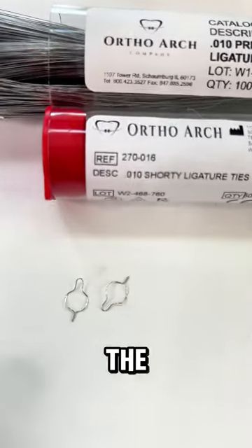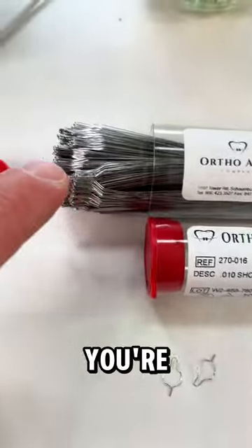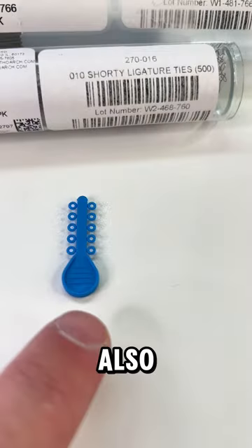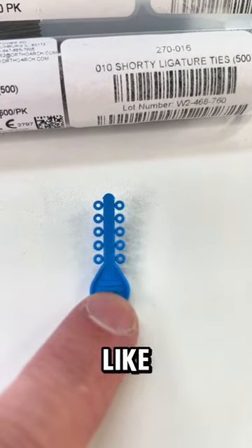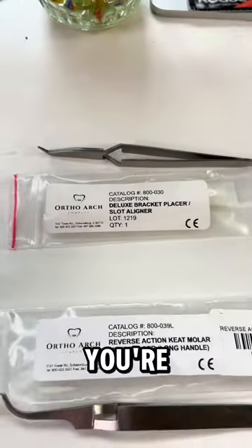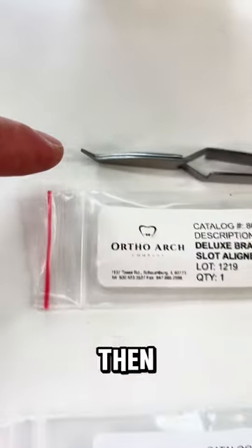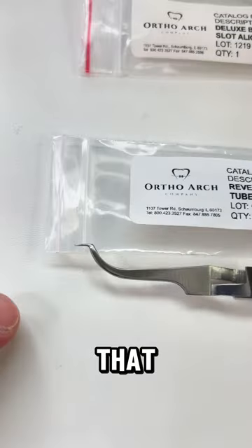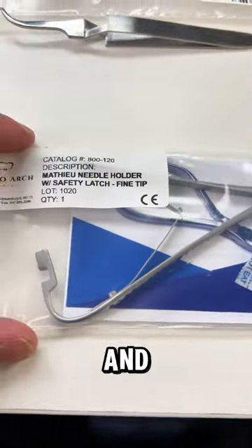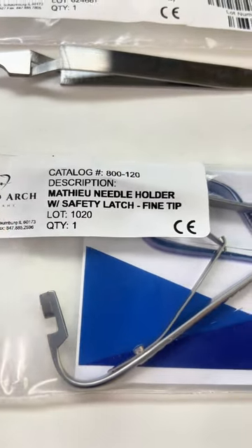You're going to need some ligature ties: short ligature ties, long ligature ties for lacing, and elastic ligatures. Then you're going to need instruments to place brackets: a bracket placer or bracket holder, and a molar tube holder. You will also need a Mathieu plier — this will help you place the arch wires as well as tie the ligature ties.